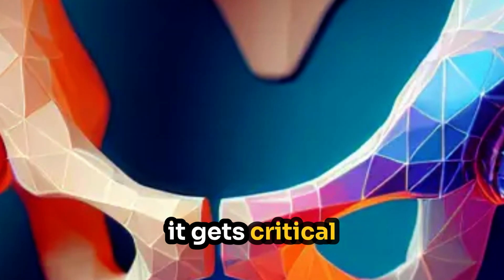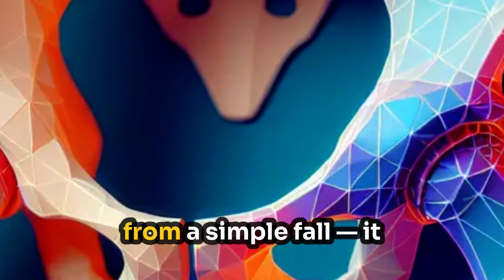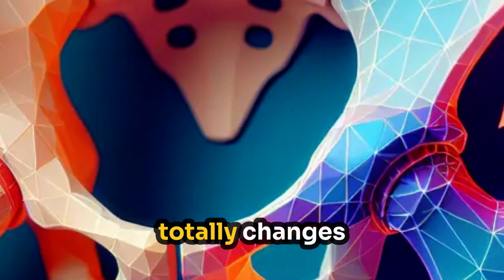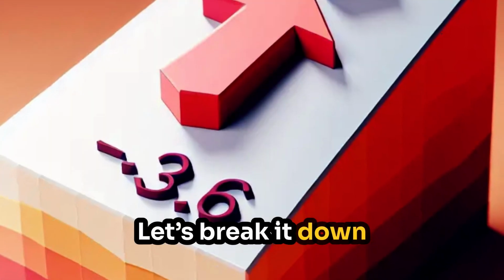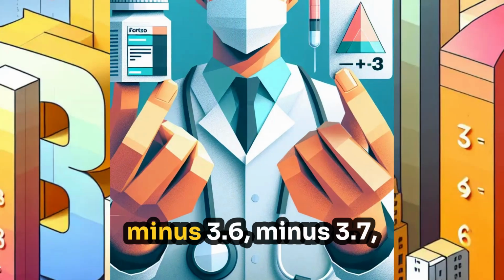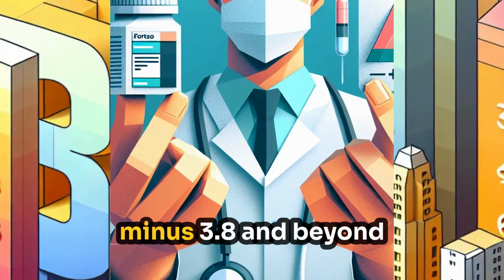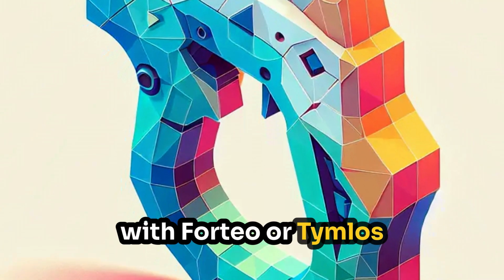Now here's where it gets critical. If a patient suffers a fragility fracture, meaning a break from a simple fall, it totally changes how aggressively we need to treat. Let's break it down. If the T-score is -3.6 or worse, meaning -3.6, -3.7, -3.8 and beyond, even without a fracture, that patient needs aggressive treatment with Forteo or Tymlos.